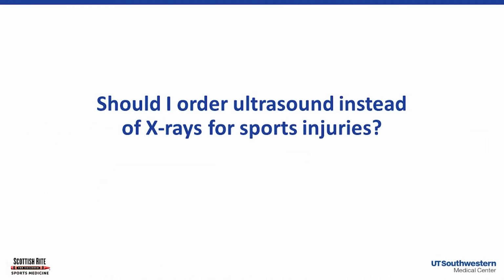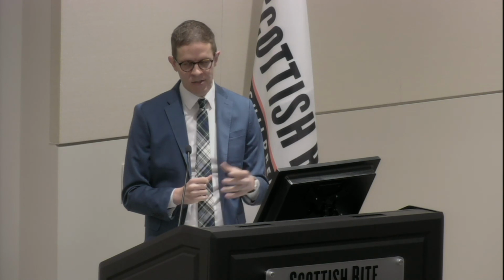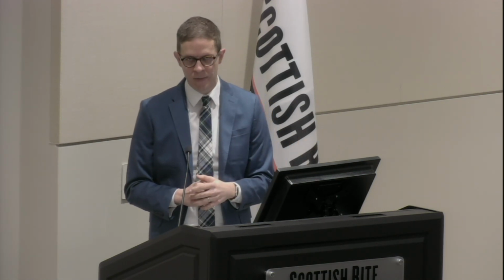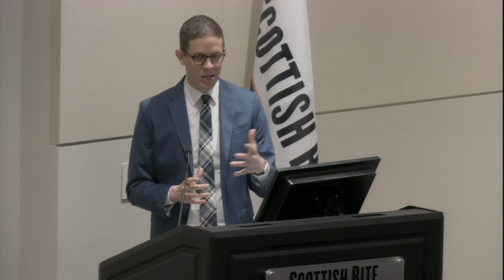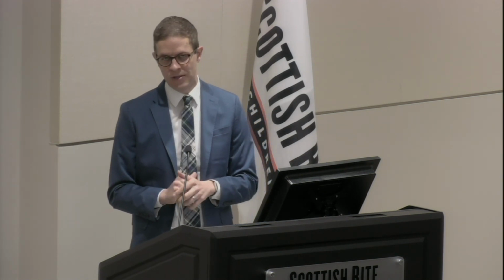Again. So next question is, should I order ultrasound instead of x-rays for sports injuries? That's a great question. Ultrasound isn't going to replace x-ray. It's not going to replace MRI. Oftentimes we use ultrasound in addition to those other things to help determine what is really going on in this patient. And then it can help determine what is the best next step to help them to get back to doing what they want to do.